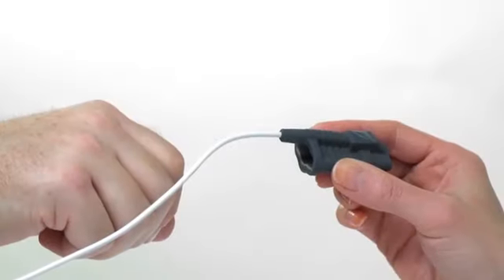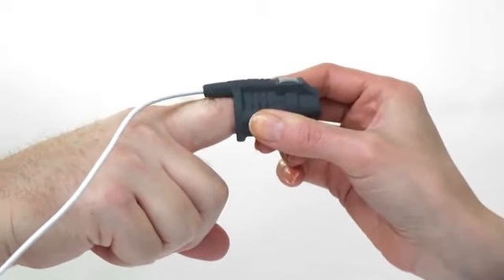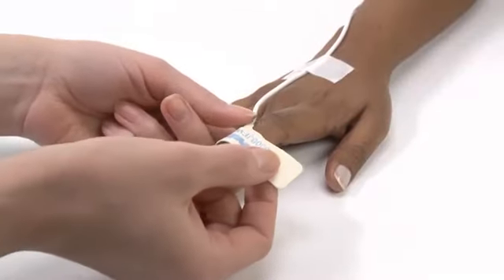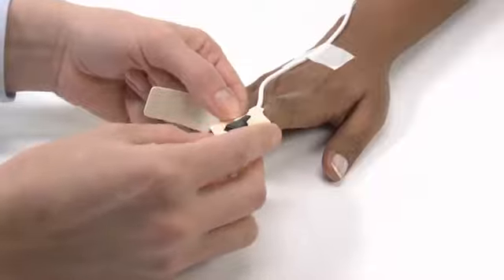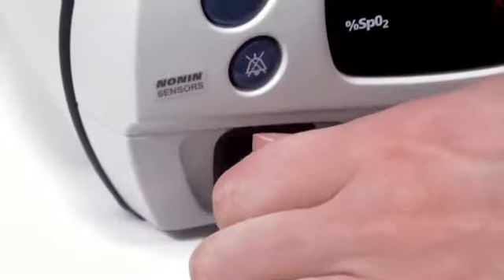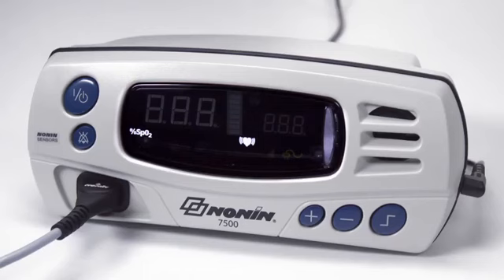Prepare the sensor and place it on the patient prior to connecting it to the oximeter. Proper sensor placement is critical for accurate readings. Follow the instructions for each sensor type to ensure secure, aligned positioning of the sensor on the finger or skin surface. Connect the sensor to the pulse oximeter by inserting the plug with the Nonin logo facing up into the sensor port on the front of the oximeter as shown here. The connector should firmly seat in the connector port on the oximeter.